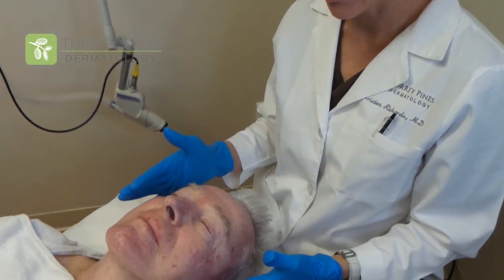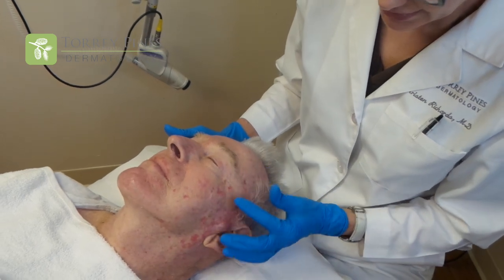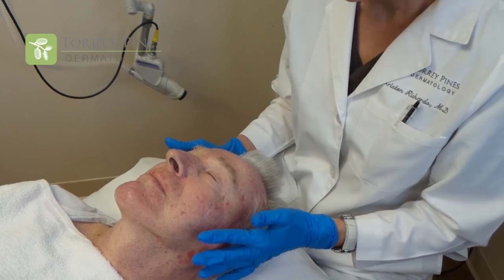Today we're going to be doing a procedure called the Active FX. Active FX is a fractionated CO2 laser that we use to remove sun damage from patients who have had quite a bit of exposure to the sun over the years. You can see our patient here has quite a bit of red and brown — all of this is from the sun, none of this he was born with.